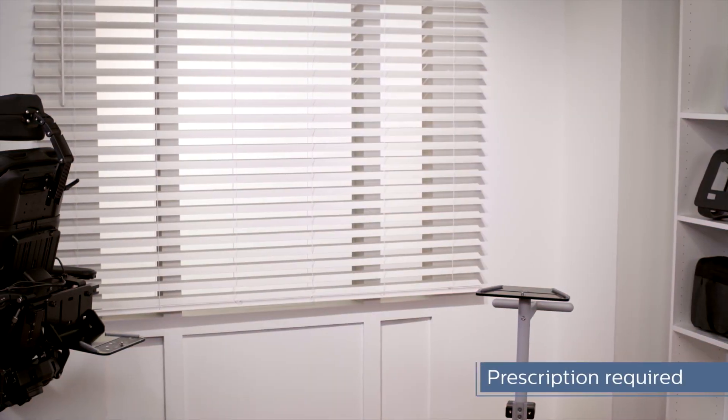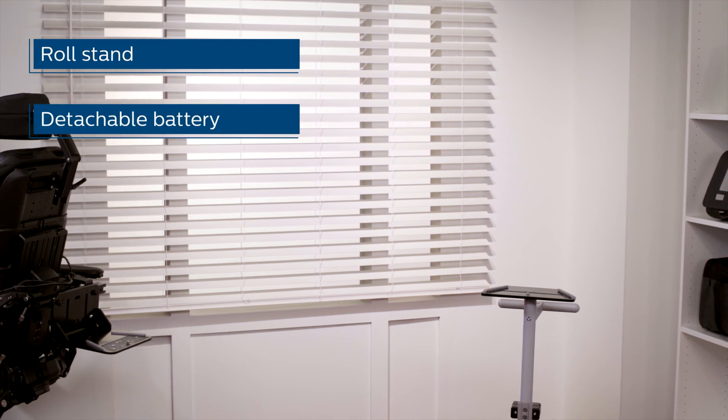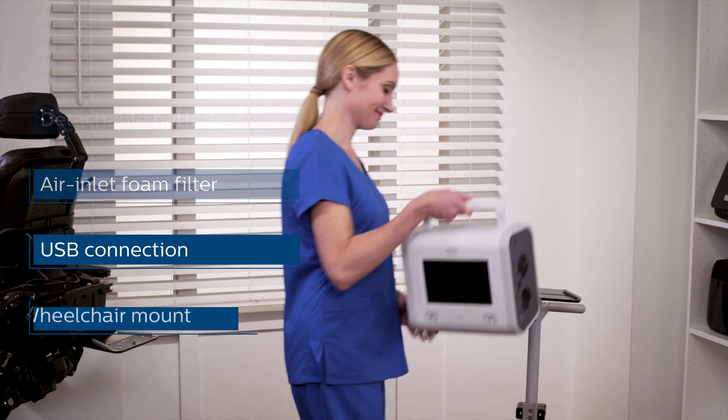Trilogy EVO is compatible with a range of accessories, including a roll stand, detachable battery, air inlet foam filter, USB connection, and wheelchair mount.